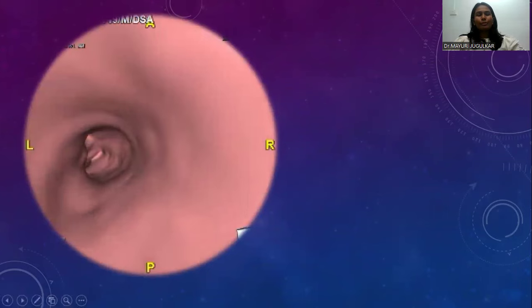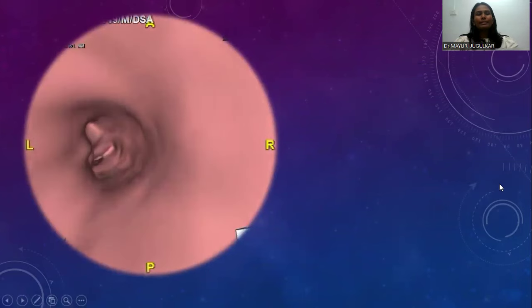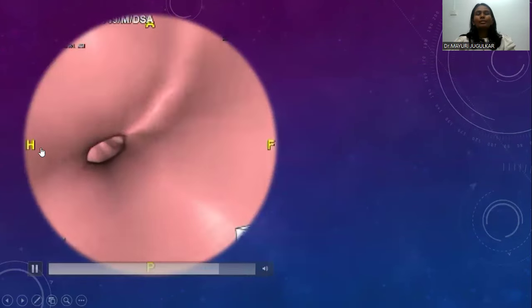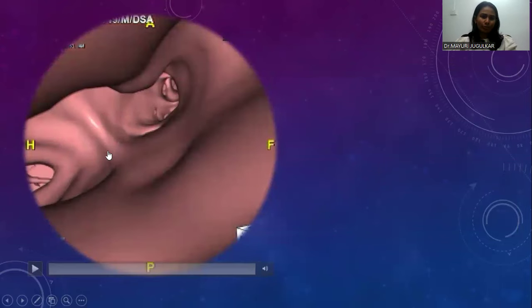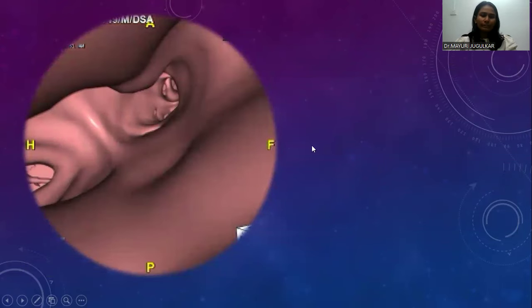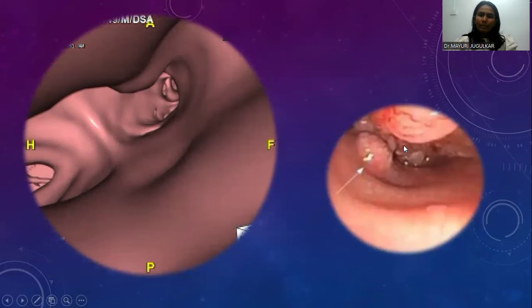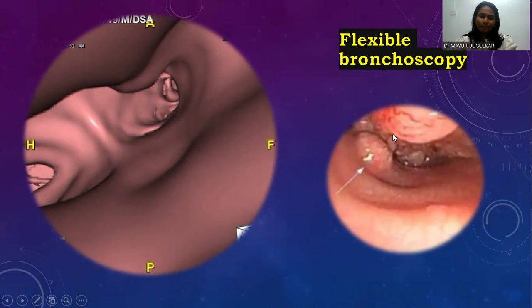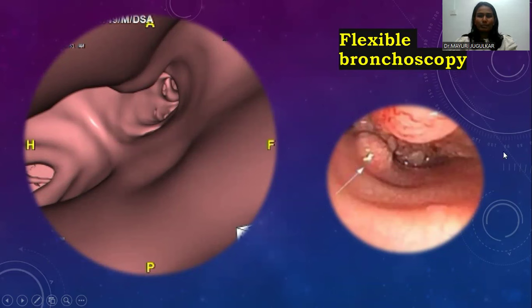On virtual bronchoscopy we can see endoluminal growth which is just at the ostium before bifurcation of the left main stem bronchus. These findings are confirmed on flexible bronchoscopy — this is the endoluminal growth which is seen just proximal to the bifurcation of the left main stem bronchus.